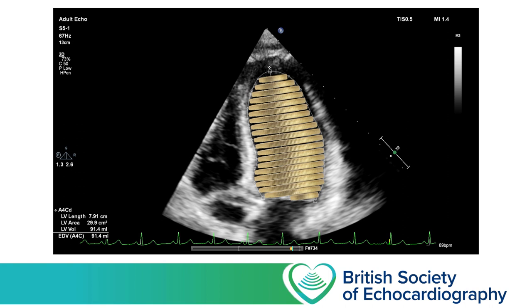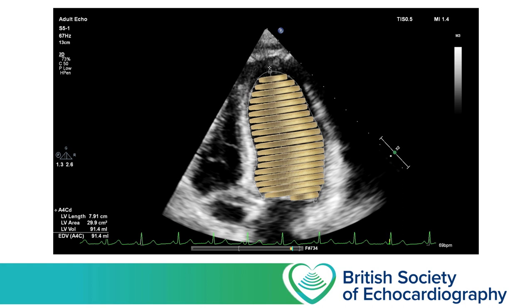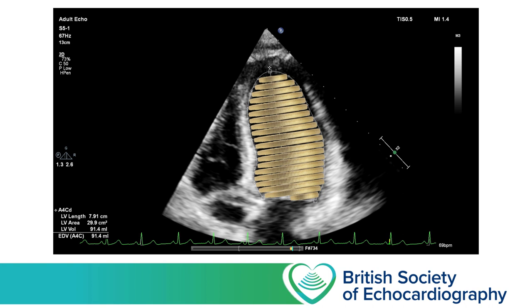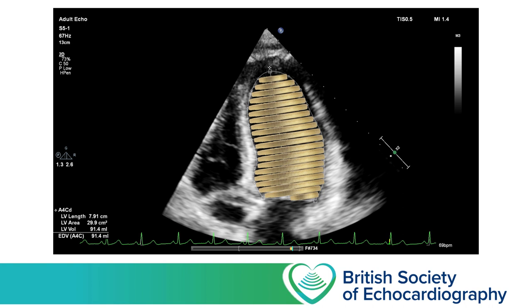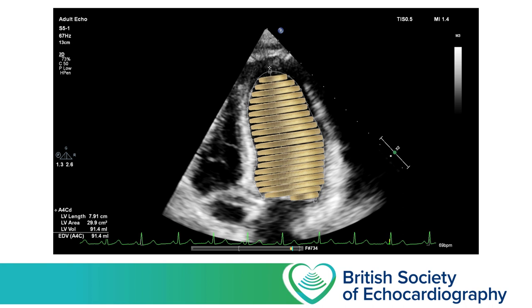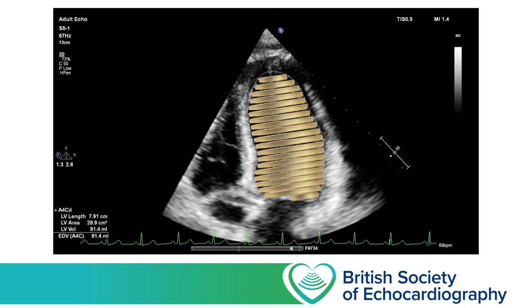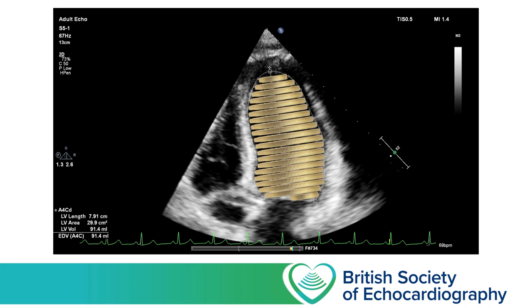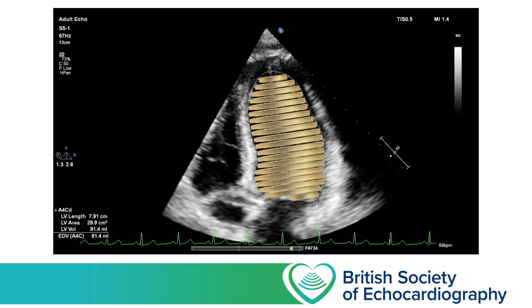Whilst you won't be performing this measurement in Level 1 studies, it's helpful to see how in a comprehensive study we convert a two-dimensional area into an estimate of a three-dimensional volume. It's also useful to see how the discs in the basal and mid two-thirds of the LV cavity have broadly equivalent diameters, and how the discs taper as they reach towards the apex in a very characteristic fashion.